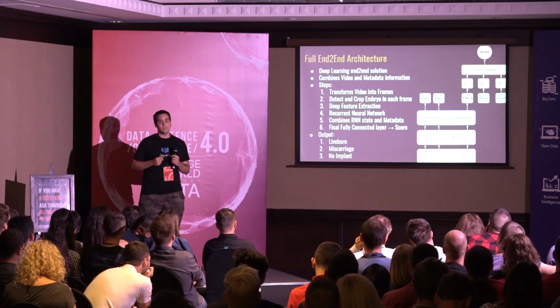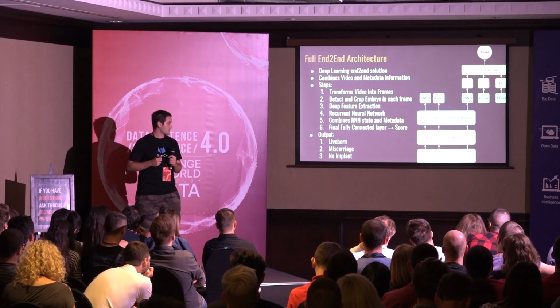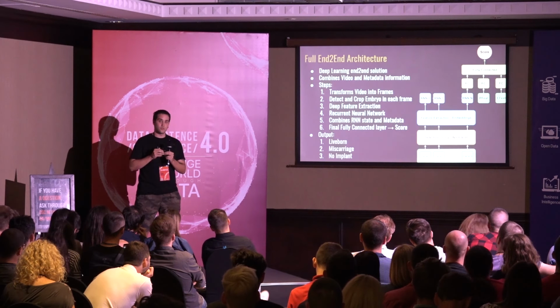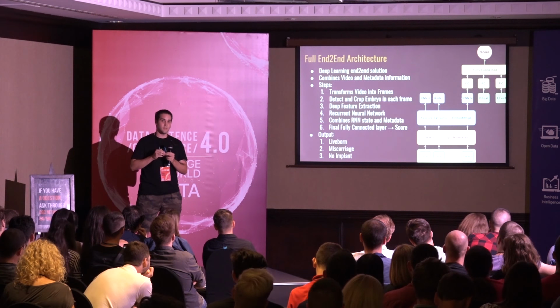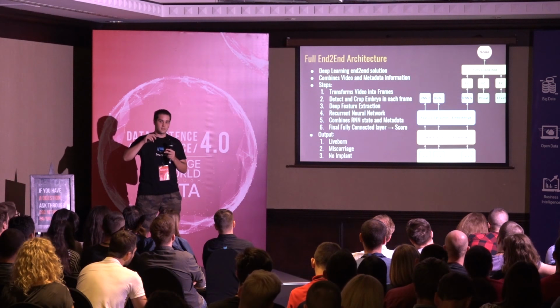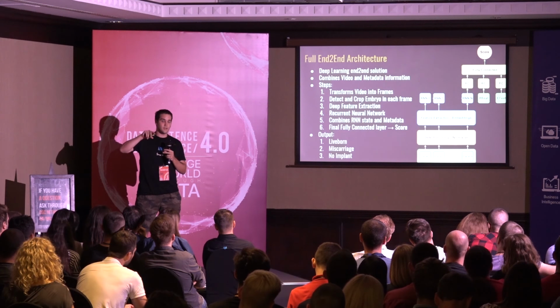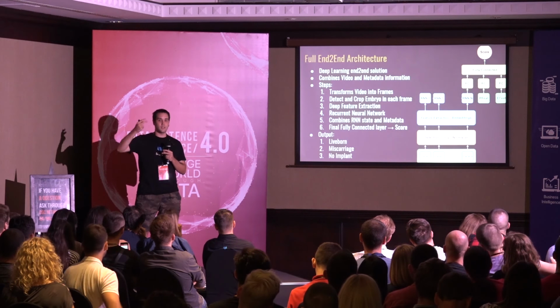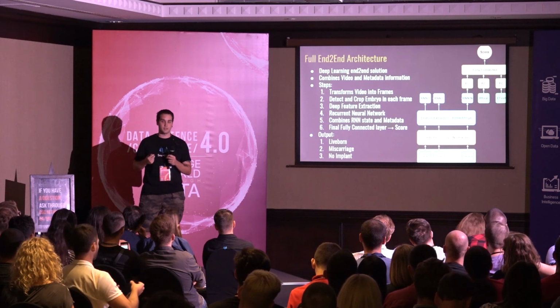And then after that, each frame is transferred to the next stage in the pipeline, which wants to find the embryo on that frame, center it and prepare it for another stage, which is the feature extractor.